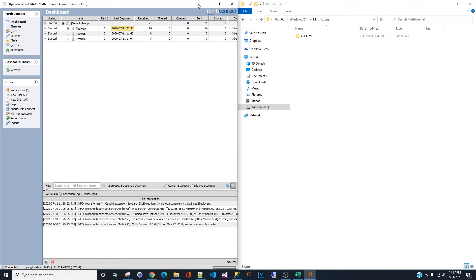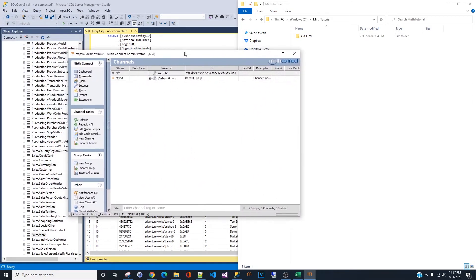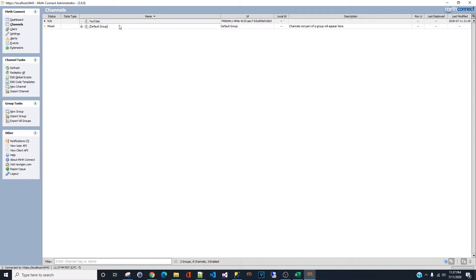To start a new channel, when you first open Mirth you will see the default group. If you want to create a new group, you would click 'Create New Group' — right here, 'New Group' — and you can type in any group name that you want.